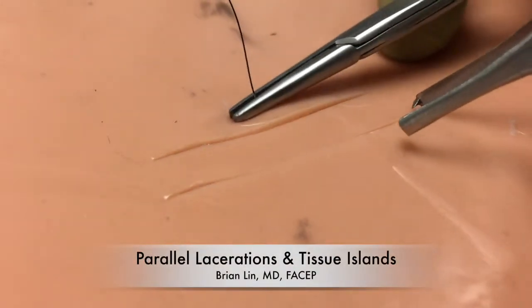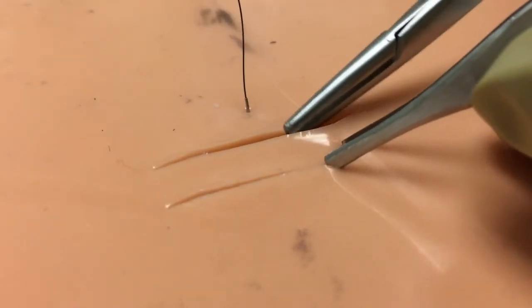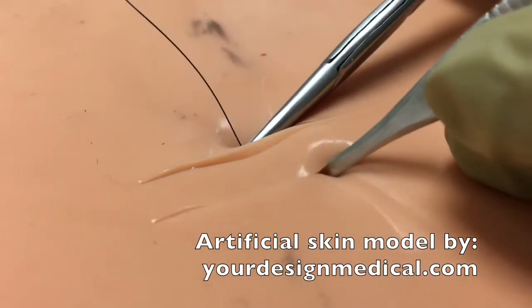This video describes a technique which can be used for the closure of parallel lacerations and for the closure of evulsed tissue islands. This is a fairly infrequent problem but is occasionally encountered in the emergency medicine setting or in the urgent care setting.